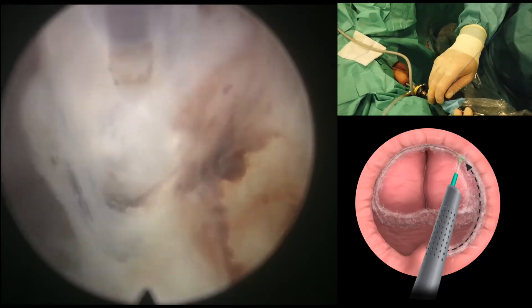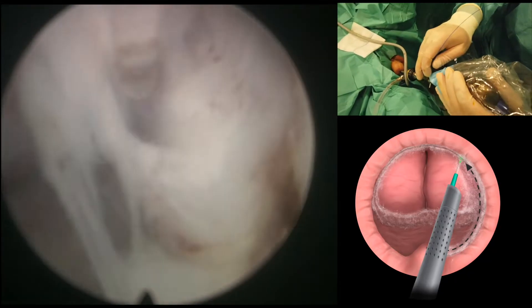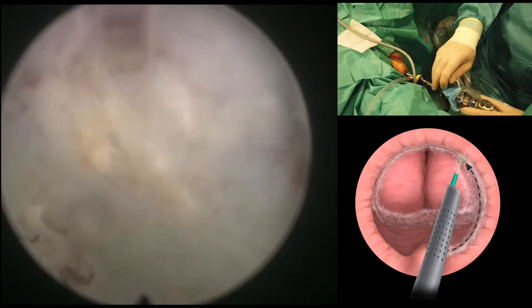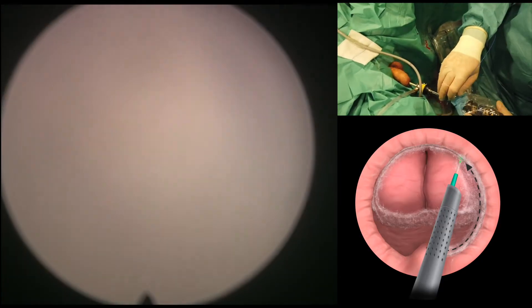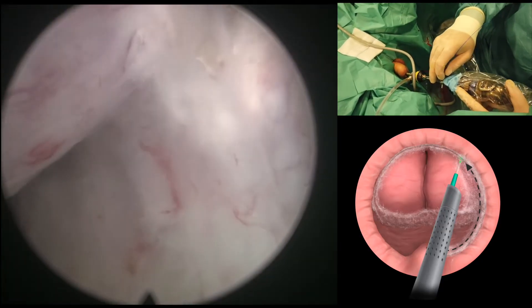We don't mind cutting three, four, five millimeters into the adenoma because that will actually detach the apex of the prostate from the sphincter and it will give us better access to this plane.